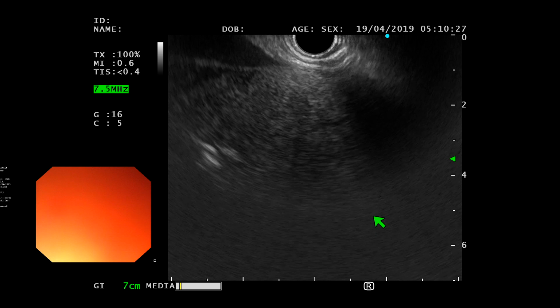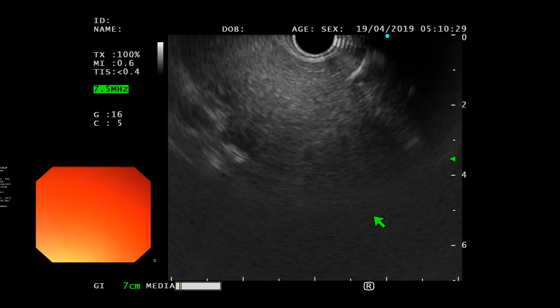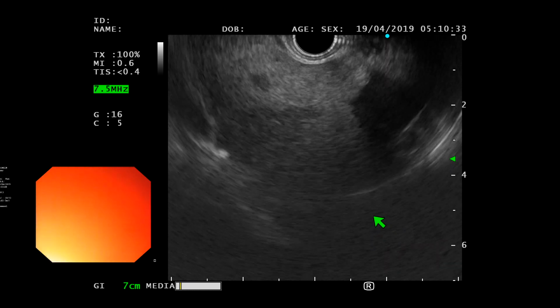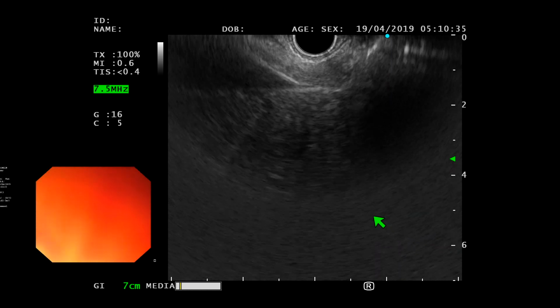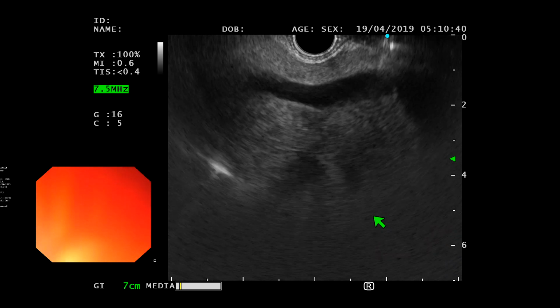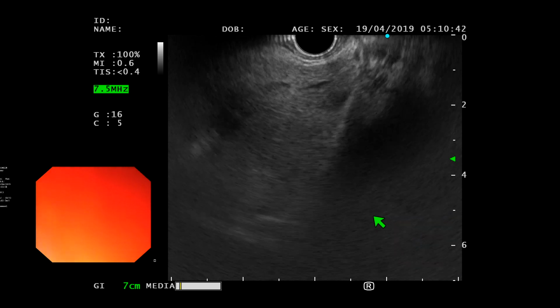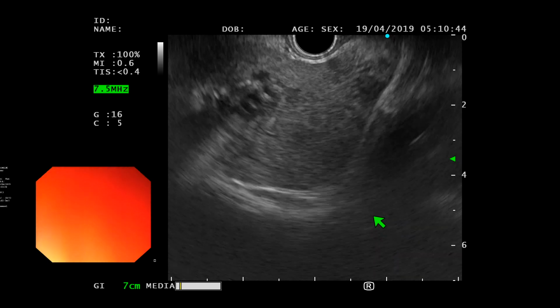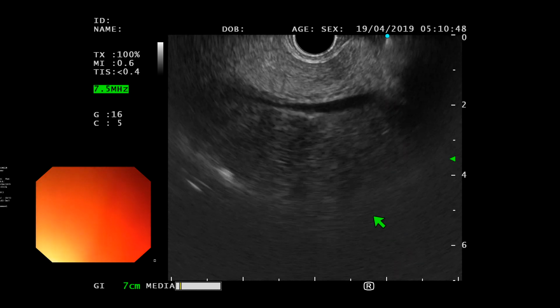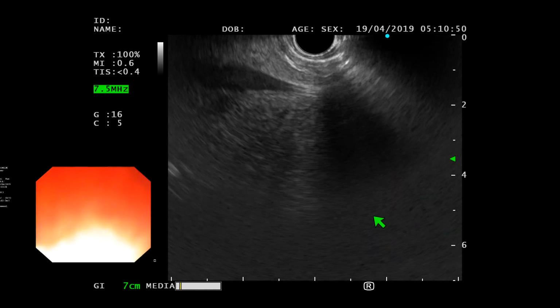If you talk to endoscopy educationists, the maximum overload that you get in endoscopy is during EUS. Why? Because you're doing two skills. You've got radiology skills and endoscopy skills that you want to combine. OGD has the least cognitive overload, followed by colonoscopy, followed by ERCP, and EUS being the most, because you've got two skills here.